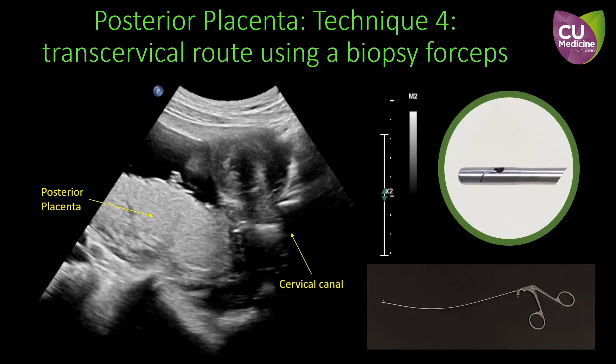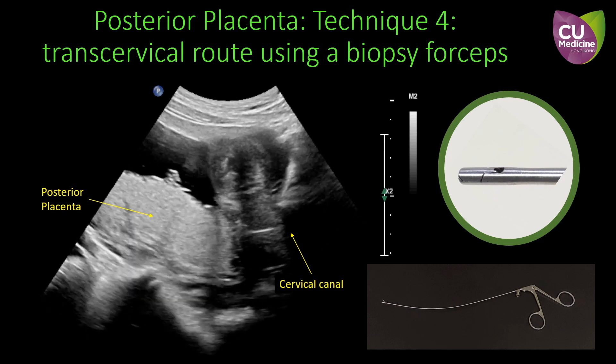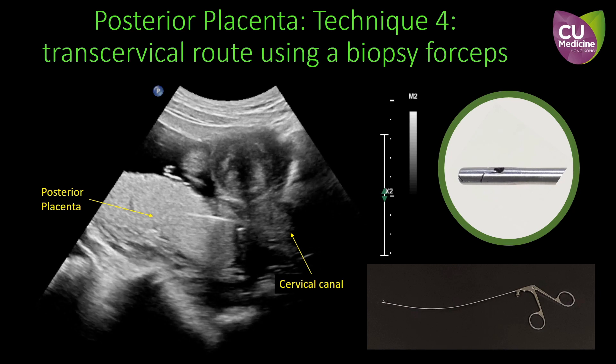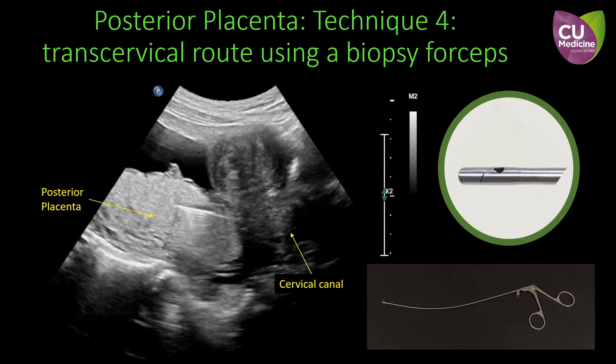Under aseptic technique and ultrasound guidance, the forceps is inserted through the cervical canal to the placenta. It is usually not difficult to pass through the soft gravid cervix. The direction of insertion may need fine adjustment along its path.